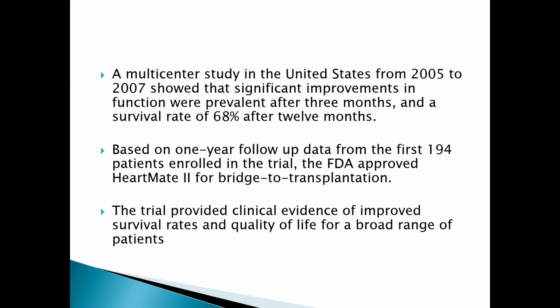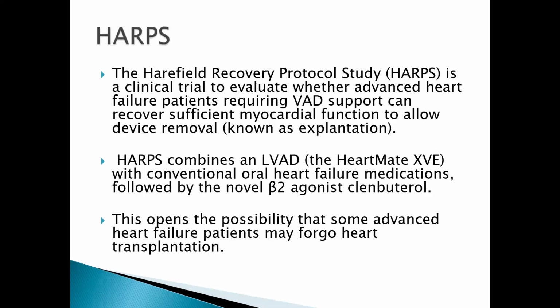for bridge to transplantation. So currently, HeartMate 2 is a ventricular assist device that has been approved as a bridge to transplantation. This clinical trial provided evidence of an improved survival rate and quality of life for a broad range of patients. So currently, HeartMate 2 is one of the devices used as a bridge to transplantation. Then there is another study that is still ongoing.